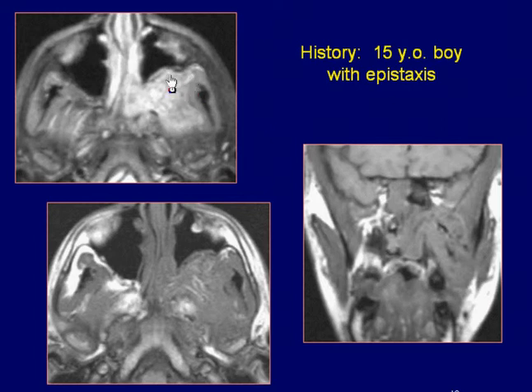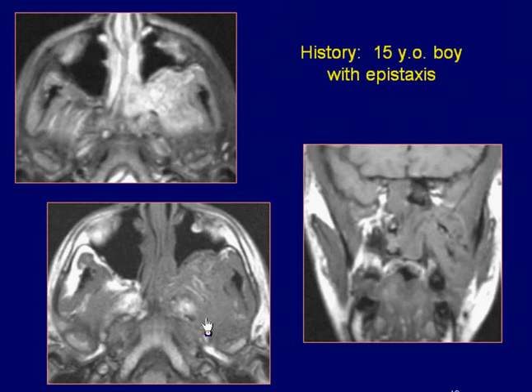the left maxillary antrum. Coronal and axial T1-weighted images demonstrate the lesion as an iso-intense area with obliteration of the left parapharyngeal fat plane. There is iso-intense signal within the right sphenoid sinus.